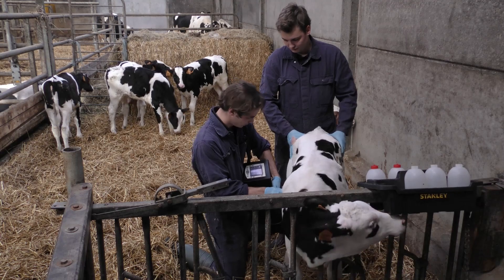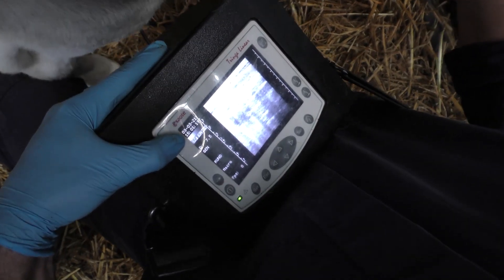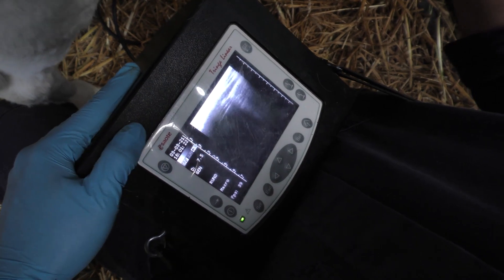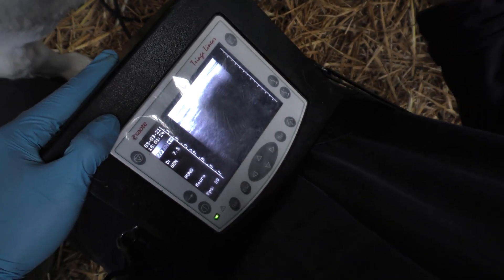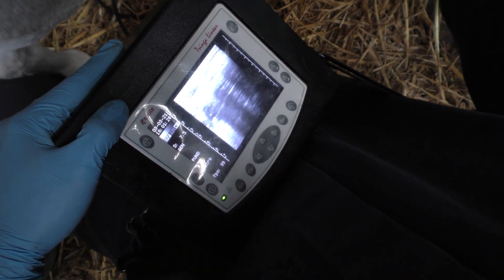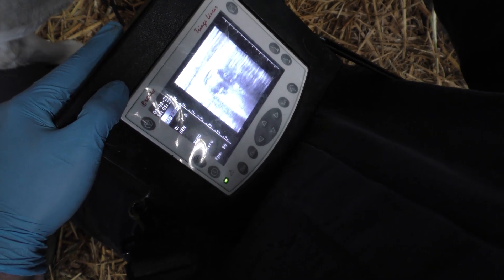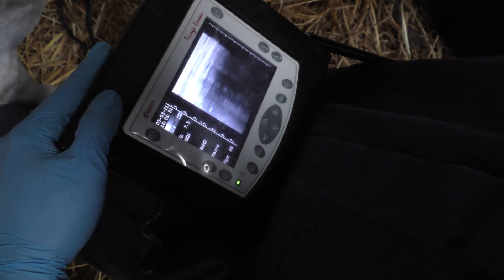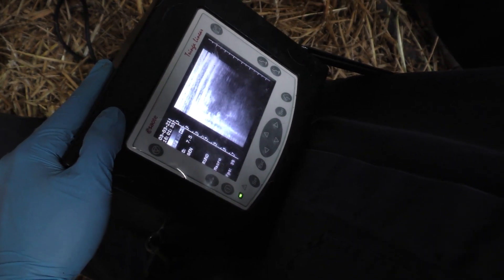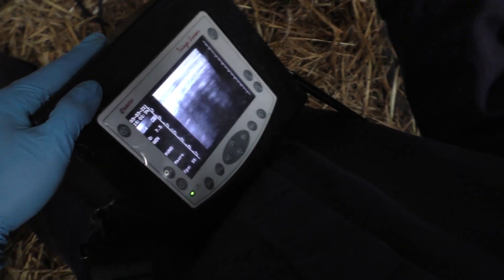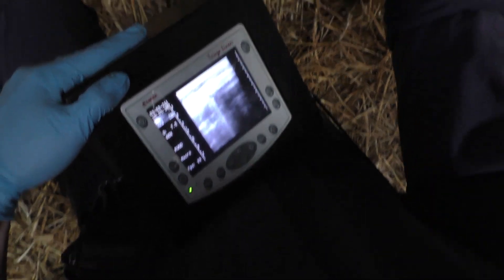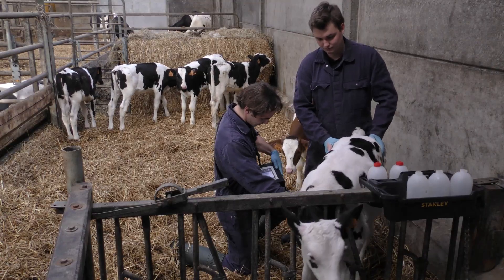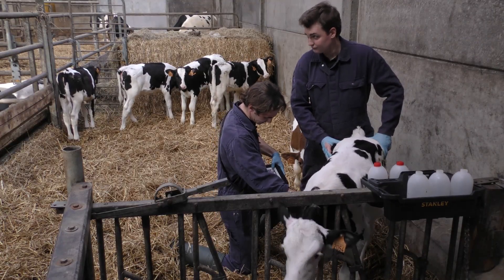Hier zien we dan de achterste longkwabben en we zien hier op dit beeld dat dit een gezond longbeeld is. Dan gaan we de probe naar voren bewegen, richting het hoofd, richting kraniaal. En scannen we eigenlijk de diafragmatische longkwab op de aanwezigheid van letsels. Hier komen we dan ook een letsel tegen, ondanks dat het dier er eigenlijk klinisch gezond uitziet. Dan zien we hier toch een letsel van makkelijk 1 tot 1,5 centimeter diep.